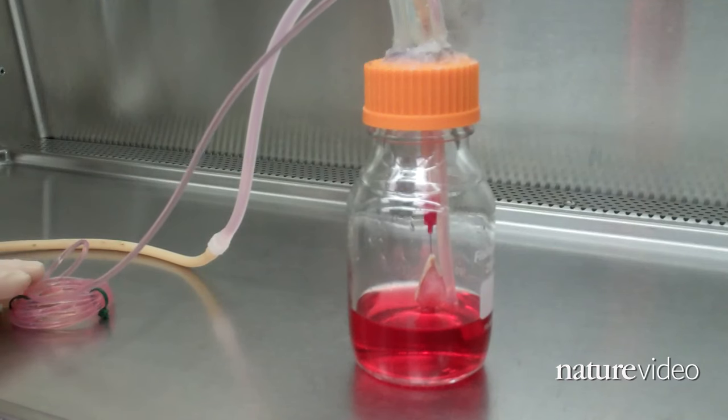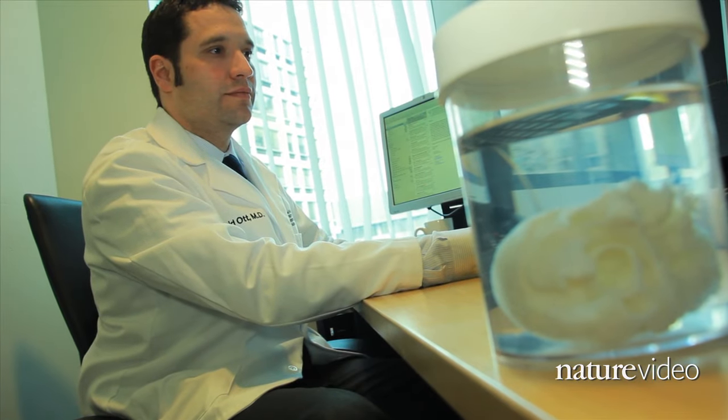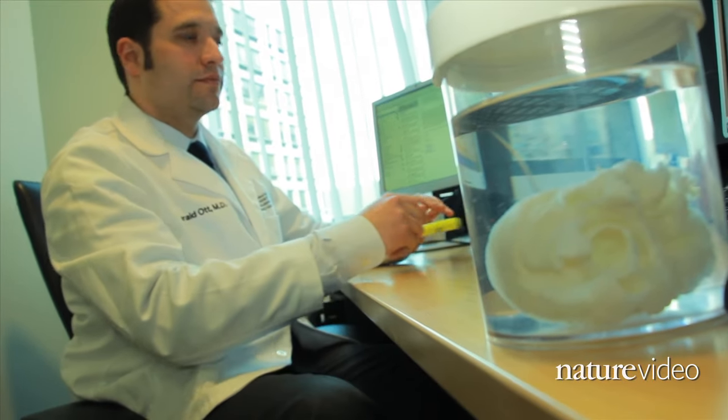The team hopes to one day completely reconstitute working hearts from a scaffold like this, but today they're focused on how they might develop parts of the heart using the same process.